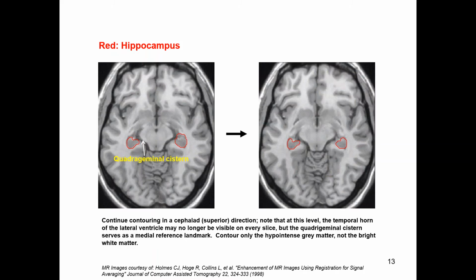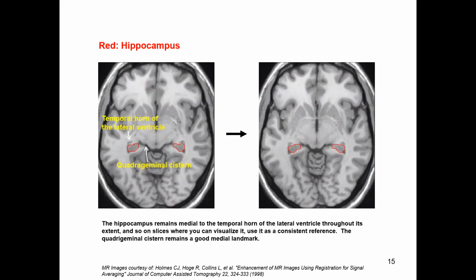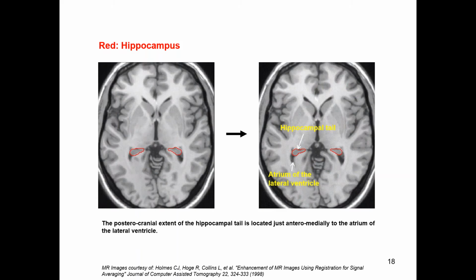Whenever you can still see the ventricle, you should delineate the hippocampus. Yes, there is still ventricle there. That's the ventricle horn also, if you can see it here. That's still the ventricle we can see, so we're delineating the gray matter hugging the ventricle. That's also.